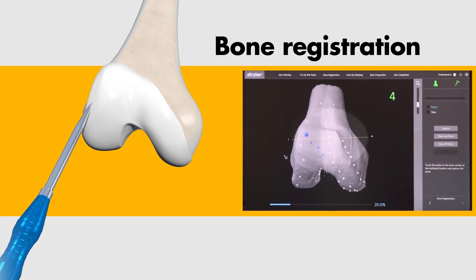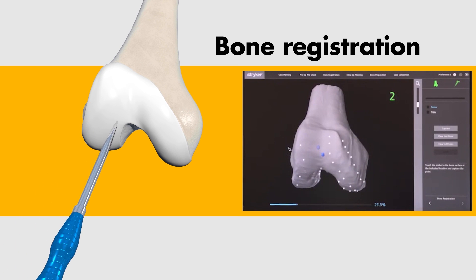During surgery, bone registration and verification are designed to align the 3D model with your patient's knee.